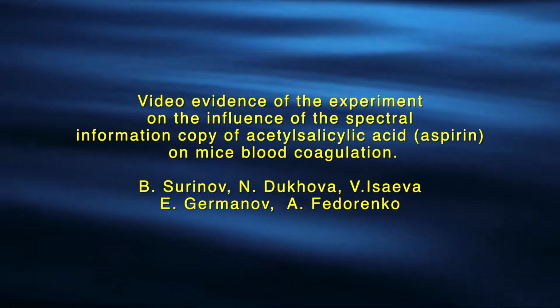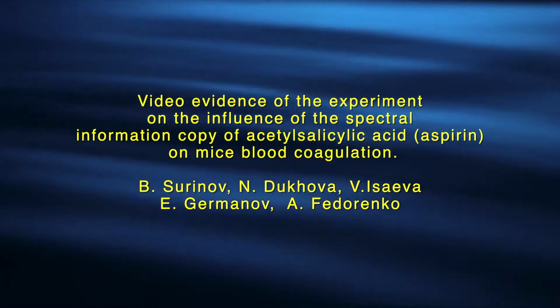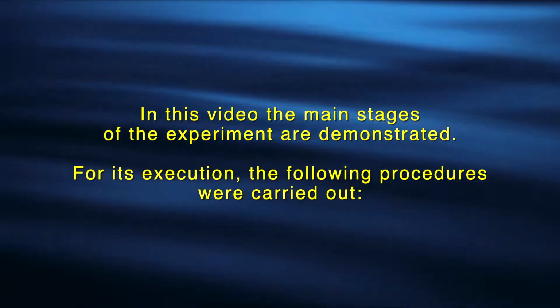This video is evidence of the experiment on the influence of the spectral information copy of acetylsalicylic acid, aspirin, on mice blood coagulation. In this video, the main stages of the experiment are demonstrated. For its execution, the following procedures were carried out.